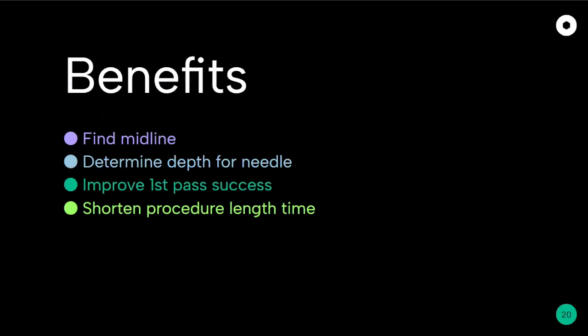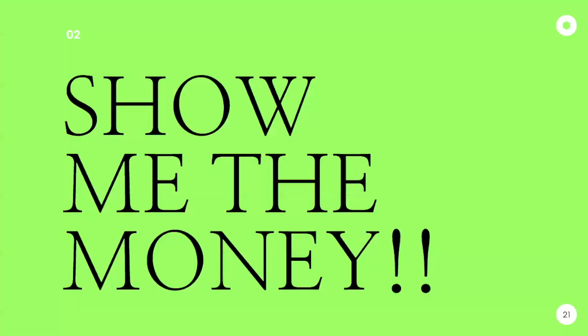As a review, there are benefits to using ultrasound to help guide this procedure. Depth, midline, it can improve your first pass success, and it can shorten your procedure length time. You don't have to turn the lights off because the rest of this procedure is not even ultrasound images, but that's okay.